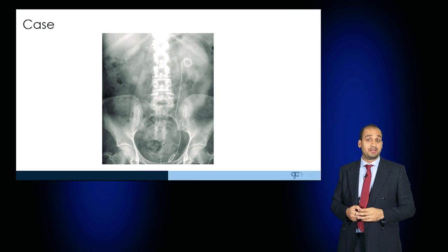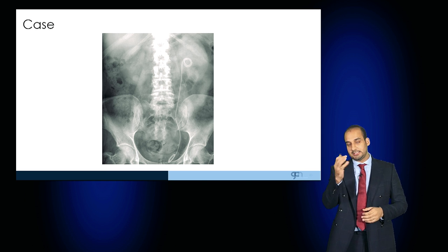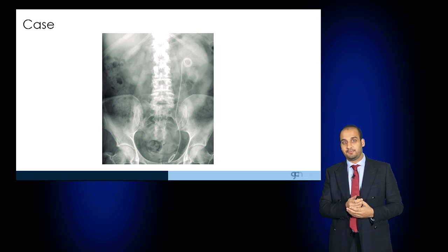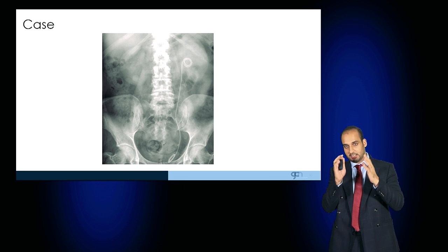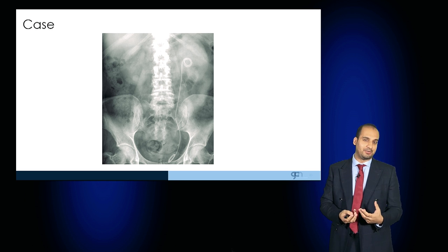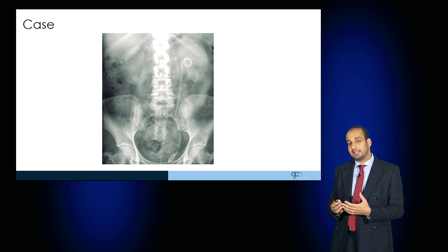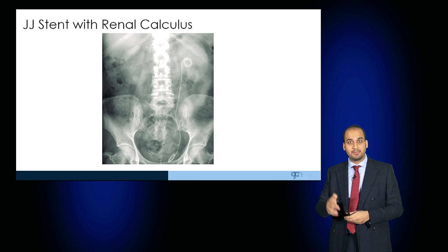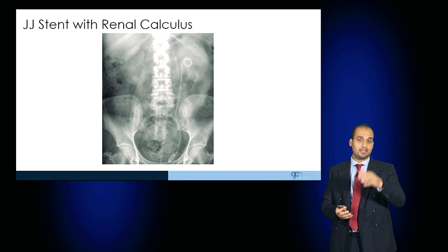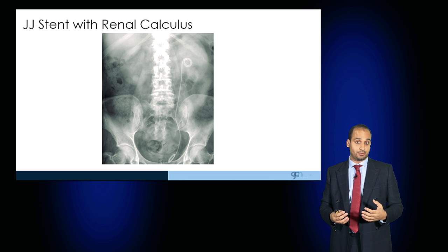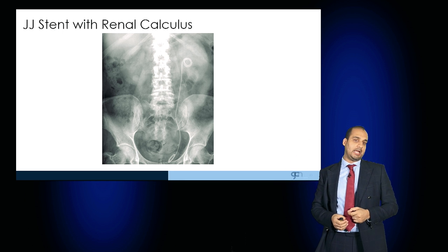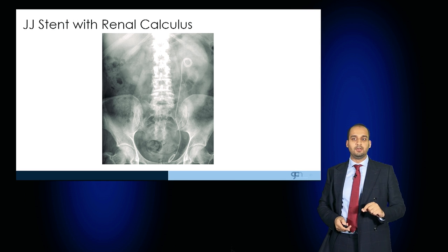Another foreign body in an abdominal film — this is known as a JJ stent, and this is in the left kidney extending all the way through to the bladder, passing through the ureter to overcome an obstruction. You can see that both kidneys look enlarged and you can just about make out their outlines — this is hydronephrosis. Perhaps this patient had a stone on the left-hand side which caused back pressure and acute kidney obstruction. A JJ stent was sited to allow fluid to flow freely out of the kidney through the ureters into the bladder, relieving that obstruction and allowing kidney function to improve. And if you look very closely at the distal end of this JJ stent, you can see a very small ureteric calculus.